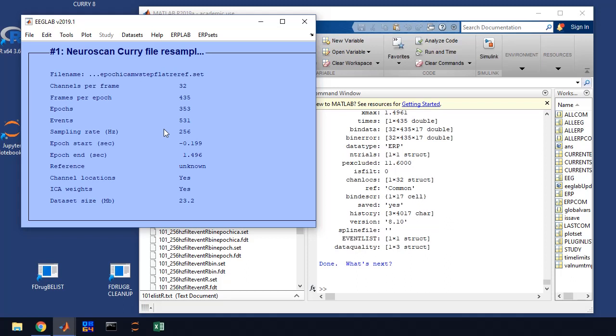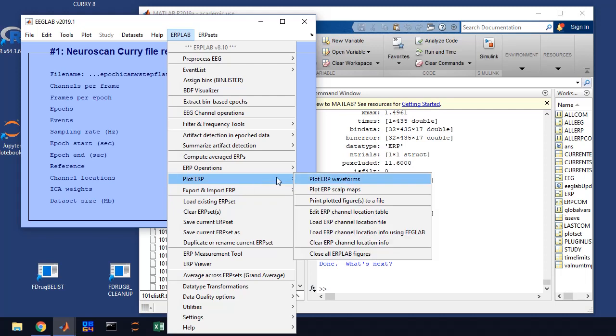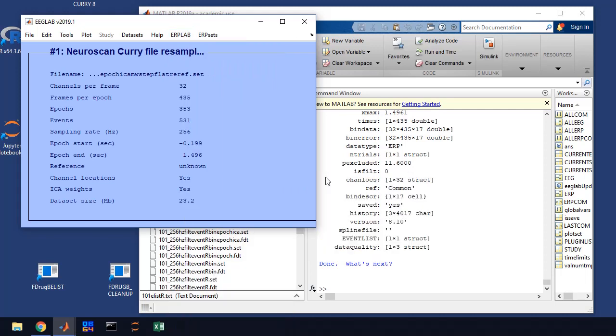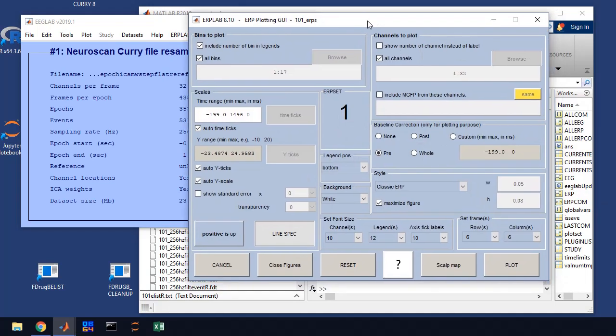Now, the last thing we're going to do is we're going to plot some of these ERPs. I'm going to pause the recording to figure out what we need to plot. Okay. So the plots are specified in your protocol. So the first thing we're going to do is plot the ERP waveforms. So we're going to go to ERP lab, plot ERPs, plot ERP waveforms.